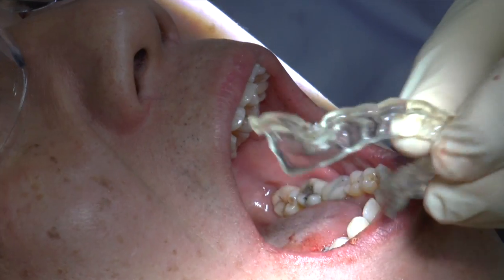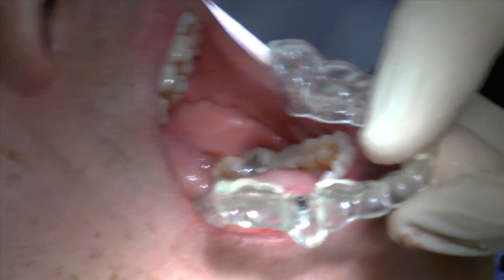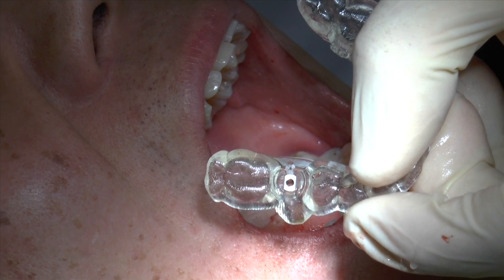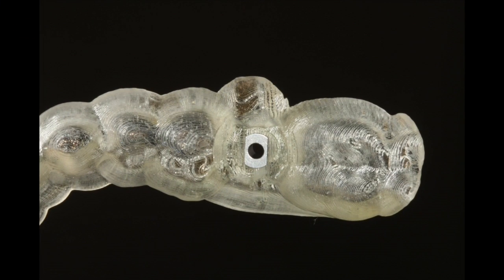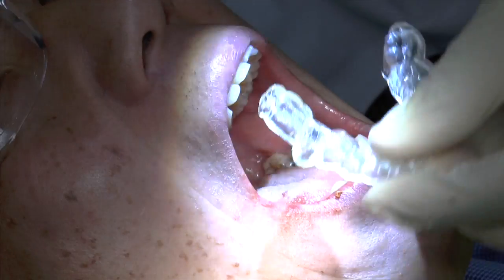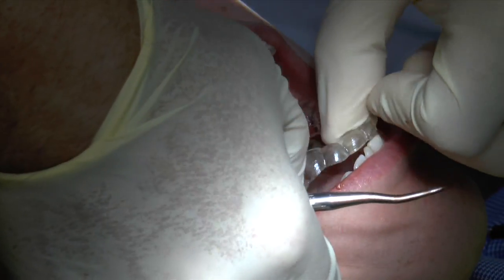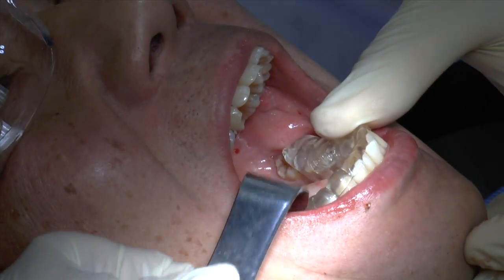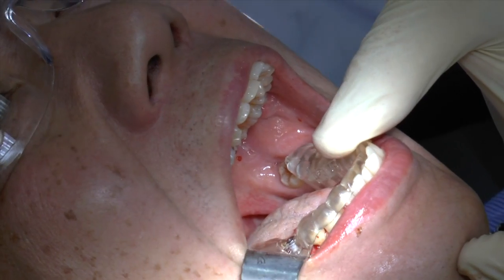So then we'll take the Smart Fusion guide, which is the 2mm guide, and take it to the mouth, making sure that it fits down, because this is going to determine the angulation of the drill — so you have to make sure it's sitting on top of the teeth properly. Let's make sure it fits on the model, and then also make sure that it fits in the mouth properly. It actually goes into the mouth without any adjustments, and this is mostly due to this being scanned on an accurate model.